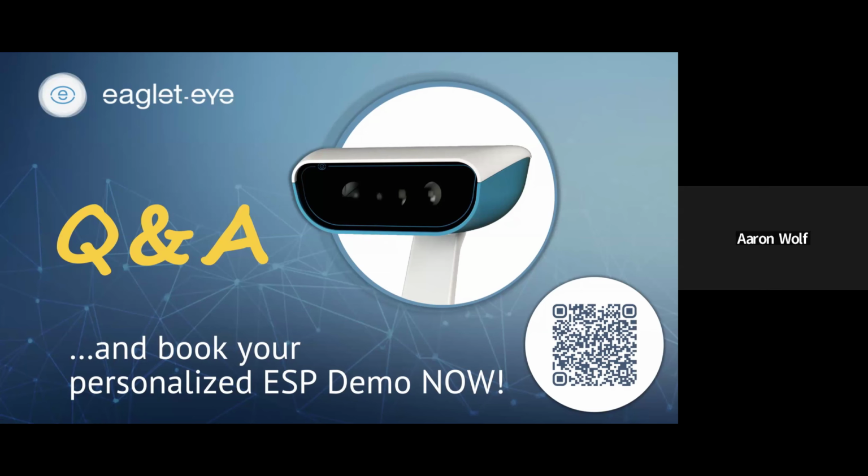As far as hybrid lenses, I don't really do hybrid lenses personally, but I know a lot of people do, and they like them, so I couldn't really comment too much on that. As far as scleral lenses, for me, I think like a lot of people, with keratoconus, I'll generally just gravitate towards that unless cost is an issue. Maybe they have a particular eyelid anatomy or something that I think they may struggle with. Langis had a great case there where he had a couple of reasons why he might not go that route, but hopefully Ted, that answered your question.